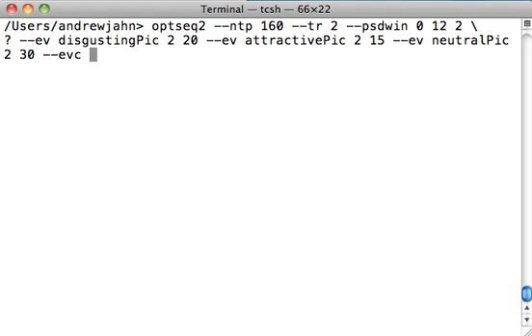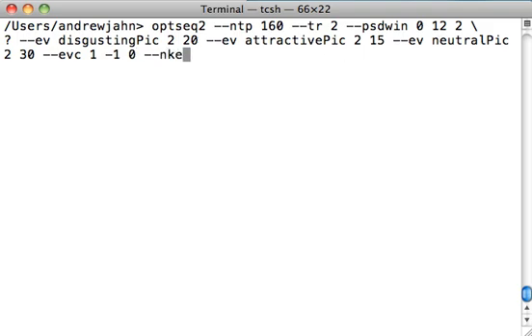Lastly, we want to optimize this for a contrast of disgusting pictures versus attractive pictures. So I type in dash dash EVC, a contrast of these events. It wants a list of weights. Let's say I want to optimize it for a contrast of disgusting pics relative to attractive pictures. In this case, I'm going to type 1, negative 1. And it needs a weight for neutral pictures. We're going to say that is 0. Does that make sense how each of these are lining up? This one lines up with disgusting pic. This one lines up with attractive pic. And the third one lines up with our third event, which is neutral pictures.